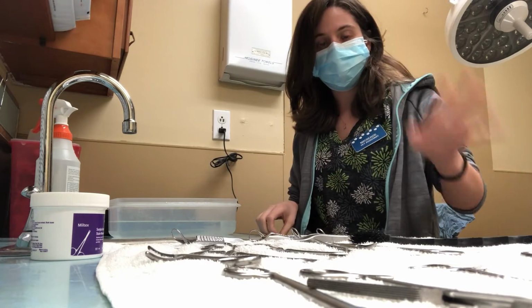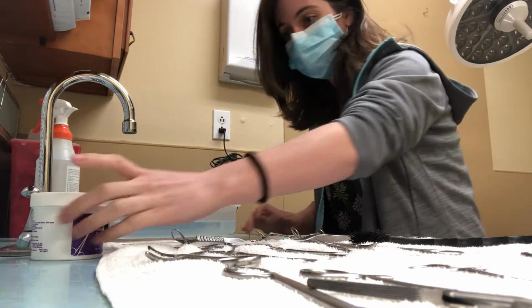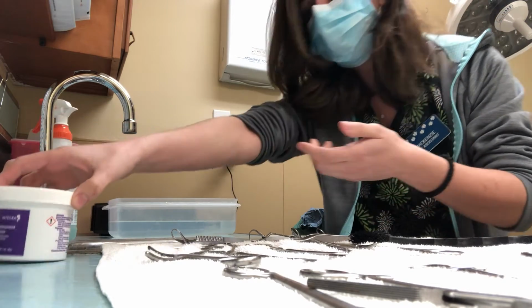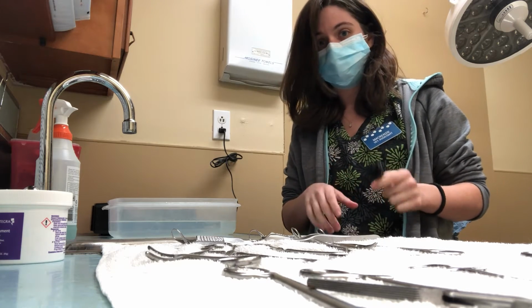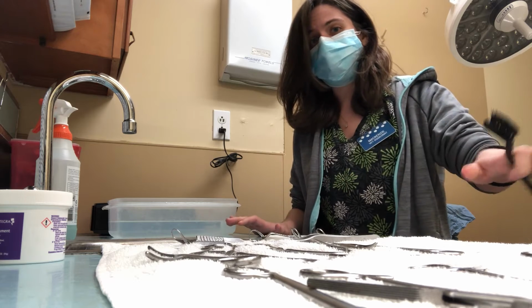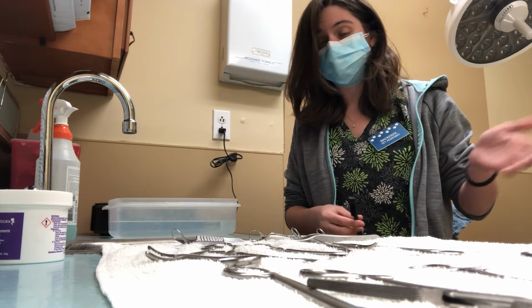So now that we have already gone ahead with our instruments and done the pre-soaking and the pre-cleaning, we can move on to the decontamination stage. So I have diluted with distilled cold water my instrument stain remover cleaner. So I'm going to take my brush and I'm going to manually clean all the different parts of the instruments, and then I'm going to rinse that off in my distilled water over here. And then I'll set them out to dry again, and then we can begin the process of packing them into their individual surgery packs and putting them into the autoclave to be sterilized.